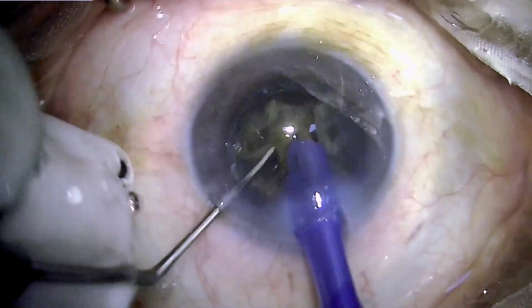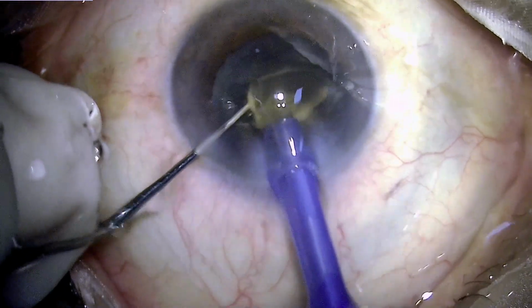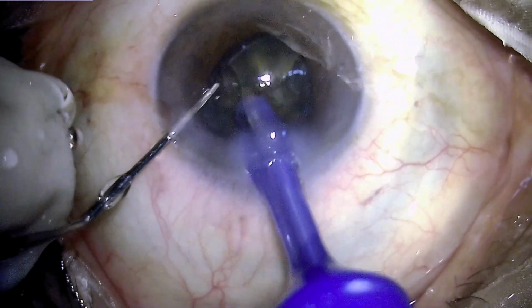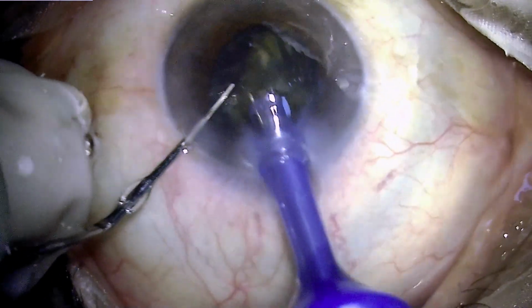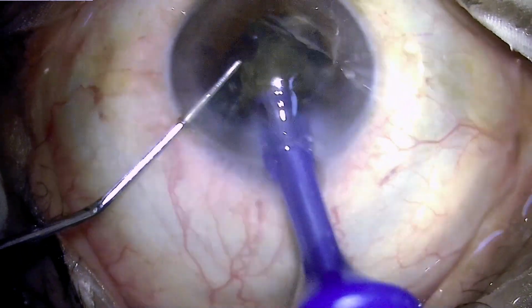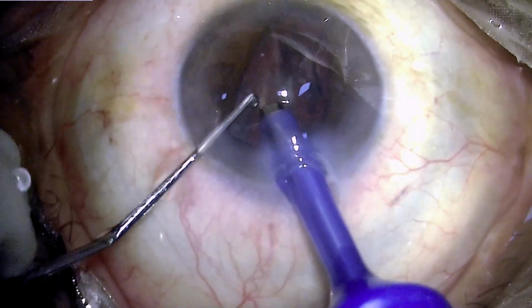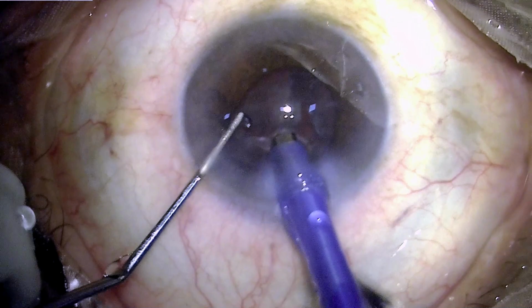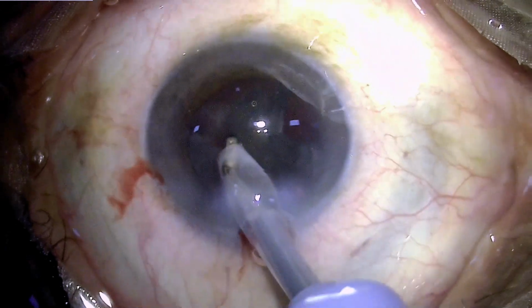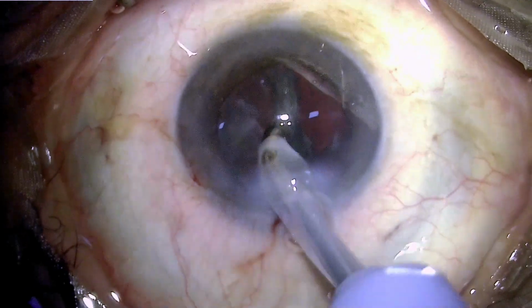Although this patient had some amount of senile miosis also, so the pupil didn't dilate very well, and during this exercise where the surge was occurring and the chamber was getting collapsed, this pupil started fatiguing out. So as the surgery proceeded, the pupil size became progressively smaller and smaller, although that was not a concern because it was still reasonable enough for me to conduct the surgery. At some point there was iris being caught in the phaco tip, but it was released immediately, and we have now proceeded to removing of the cortical matter.